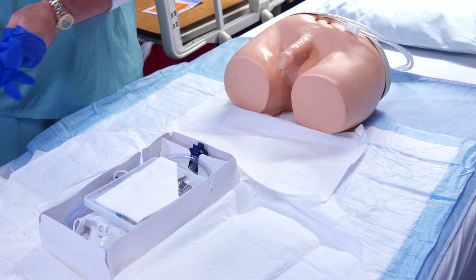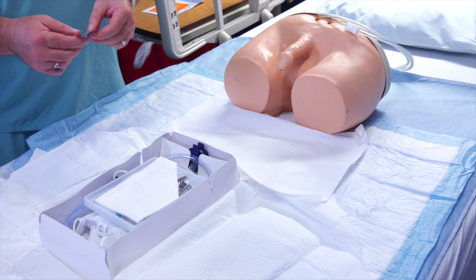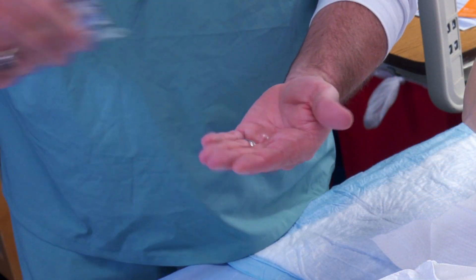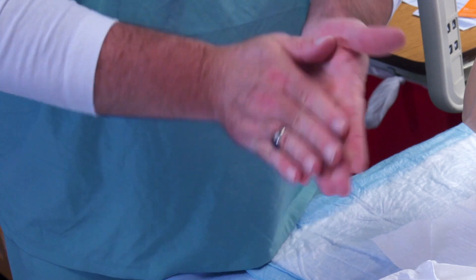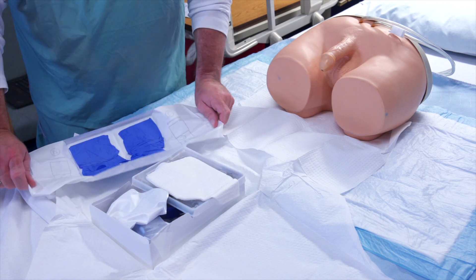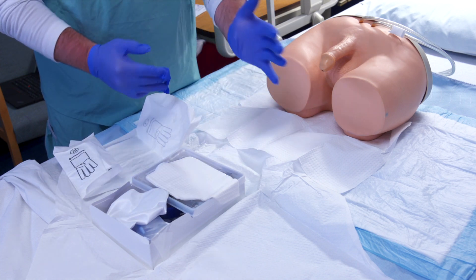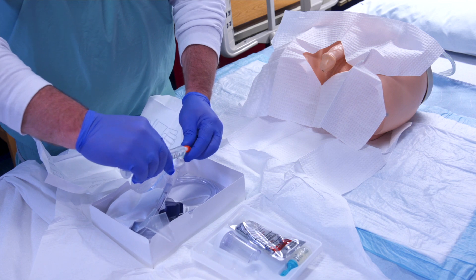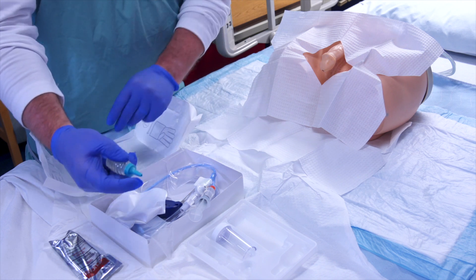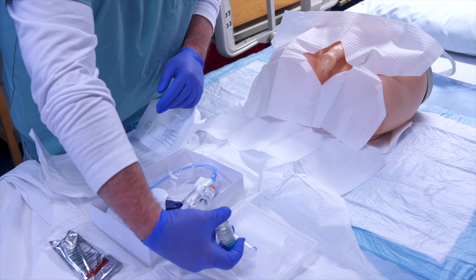Retrieve the Castile soap provided or use what is designated by your facility's protocol and cleanse the perineal area. Remove and dispose of non-sterile gloves and perform hand hygiene using the provided hand sanitizer. Don sterile gloves provided in the closed system tray. Always keep your hands above your waist and in front of you — do not touch anything that is non-sterile. Explain to the patient that you will be prepping for insertion and that they will feel your hand and the cool prepping solution. Place the fenestrated drape over the perineum. Connect the pre-filled sterile water syringe to the inflation port on the catheter; you do not need to pre-inflate the balloon. Open the water-soluble lubricant and squeeze the bellows syringe into the tray compartment and discard the empty container. You may also save some lubricant in the container for placement directly into the meatus.